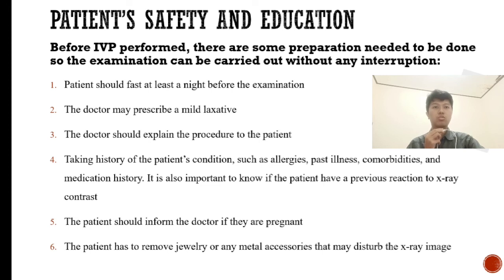It is also important to know if the patient has had a previous reaction to X-ray contrast. The fifth is the patient should inform the doctor if they are pregnant, so the doctor won't do many tests that will expose too much radiation to the fetus. The sixth is the patient has to remove jewelry or any metal accessories that may disturb the X-ray image.